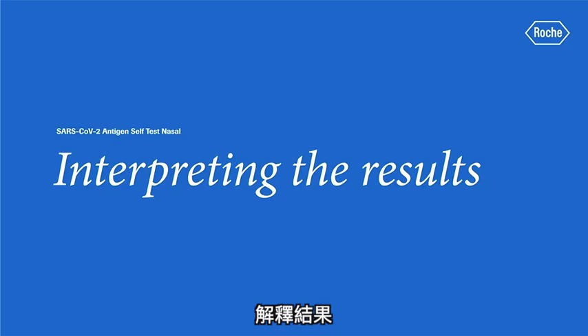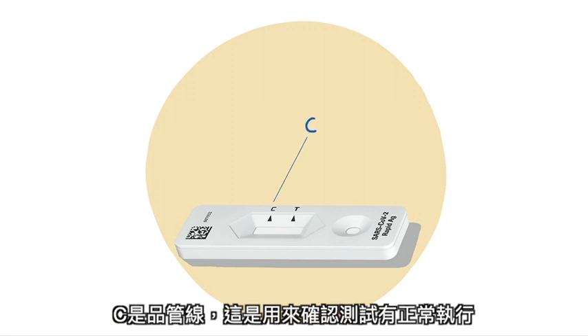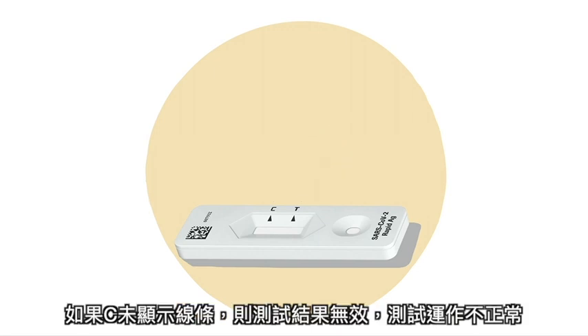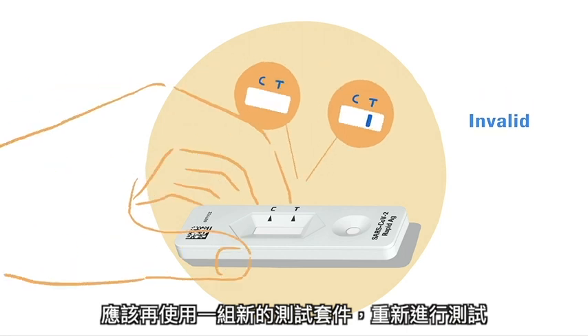Interpreting the results. There are two letters next to the result window. C stands for control line, which shows if the test works properly, while T is the test line indicating the infection status. If there is no control line C visible, the result is invalid — the test did not work correctly and you should perform another one.